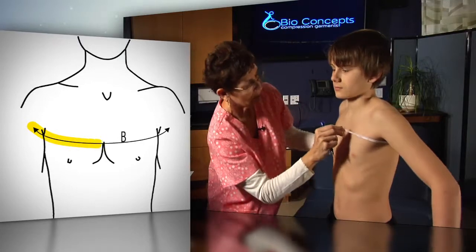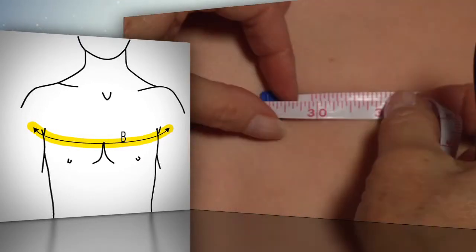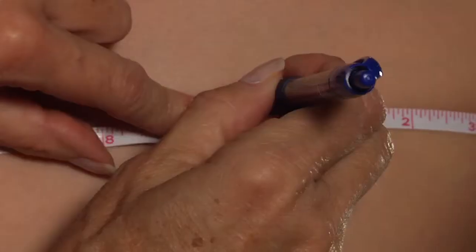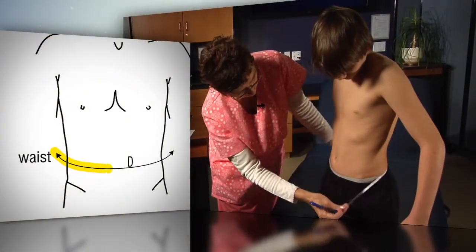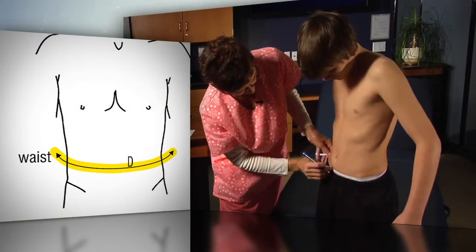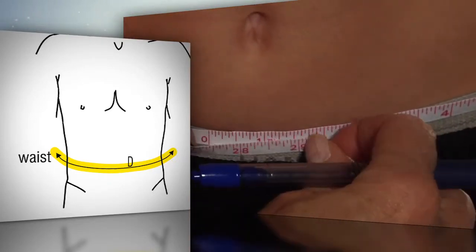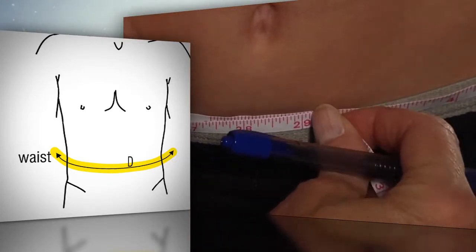The capital B measurement is the circumference of the torso at the axilla. Make sure you make a mark on the anterior torso where the capital B circumference is taken. The capital D measurement is the circumference at the waist. The waist is defined as the level at which the patient wears pants, panties, briefs, or skirts.